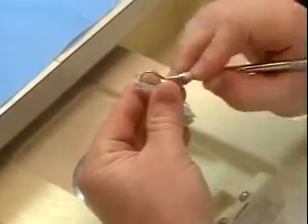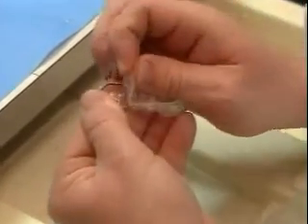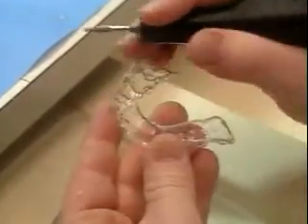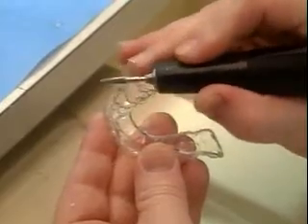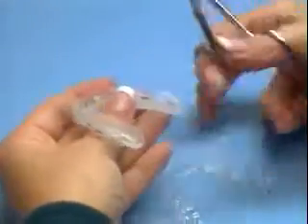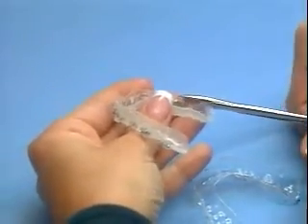Separate the soft inner tray from the hard outer tray. This will make tray removal easier during the bonding. Smooth the hard edges for patient comfort. An acrylic burr may be useful. Trim the edges of the soft tray, especially around hooks, to facilitate tray removal.